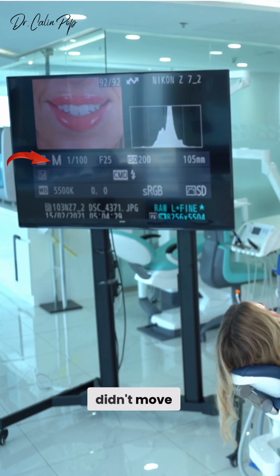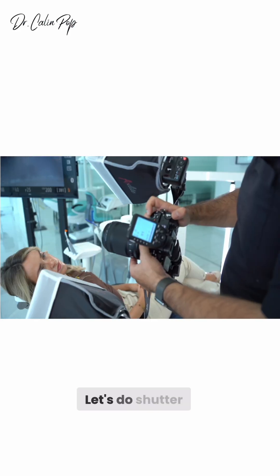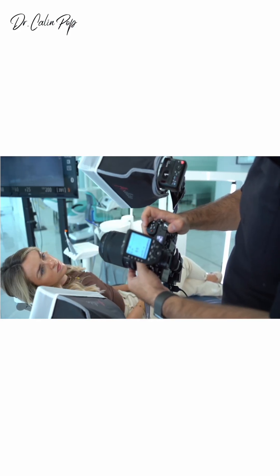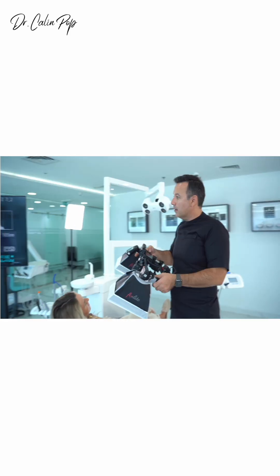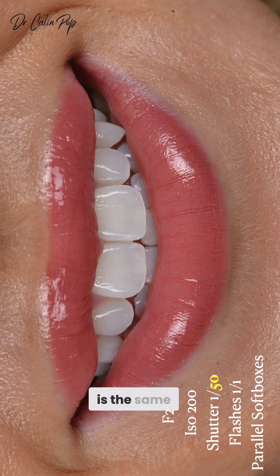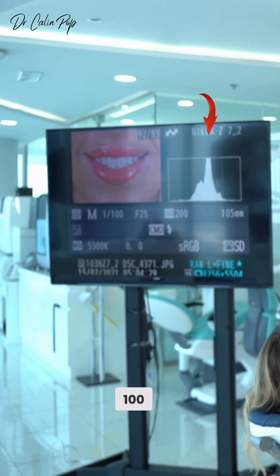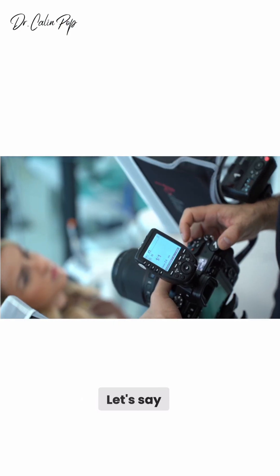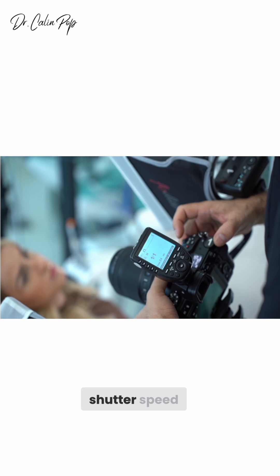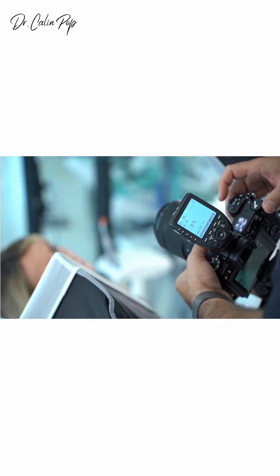Let's go even lower — shutter speed 1/50 of a second. The exposure is the same across 1/50, 1/100, and 1/200. Let's go all the way down to 1/10 of a second, so this will be really slow.